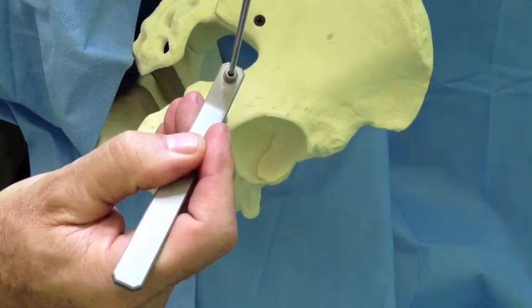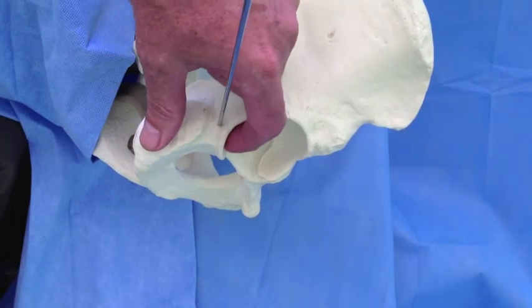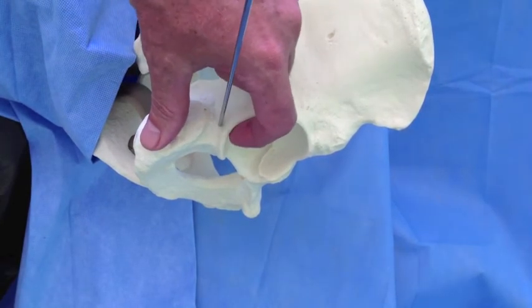Align the drill guide and insert the base point pin about 10 millimeters. Then remove the drill guide. Check the inside of the acetabulum to make sure that the pin did not penetrate.